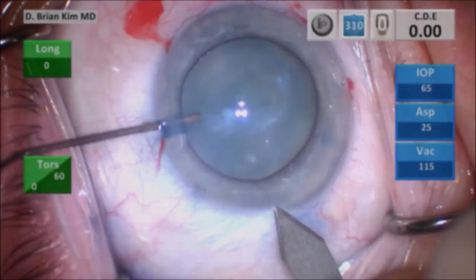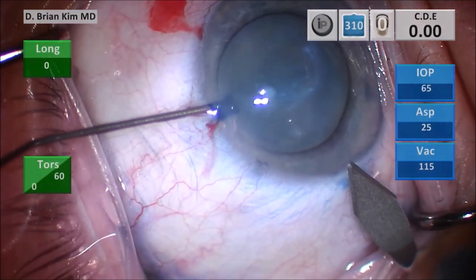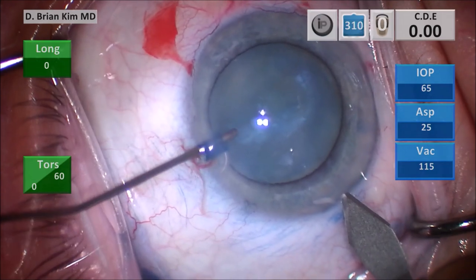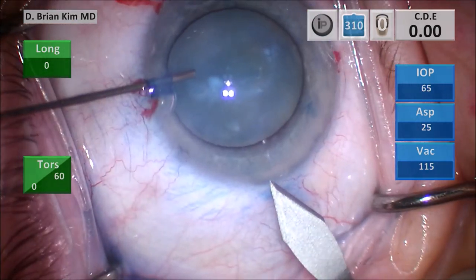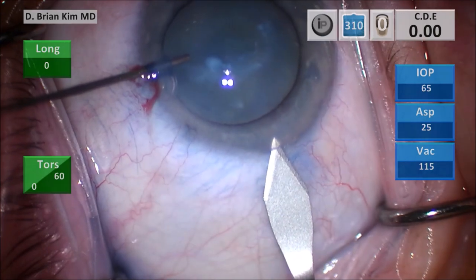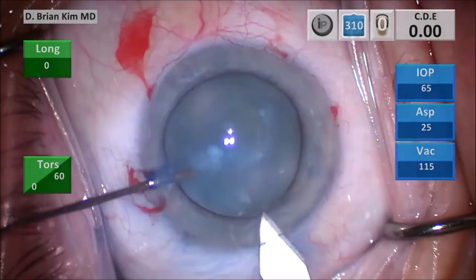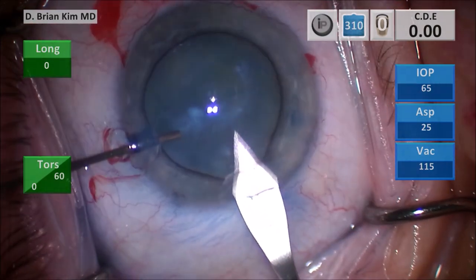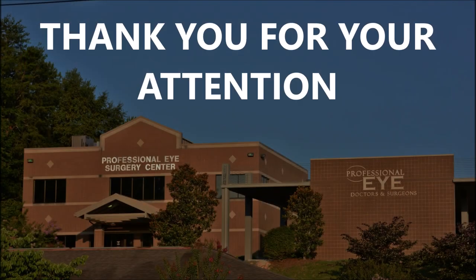So this is again why I prefer a triplanar corneal incision. With a triplanar corneal incision, you have much more stroma on the external most component of the incision, and this is why I think a triplanar corneal incision is a better incision. I hope this was helpful to you, and thank you for your attention.